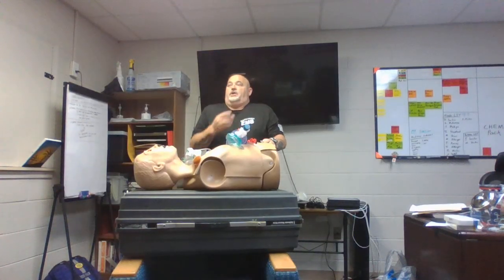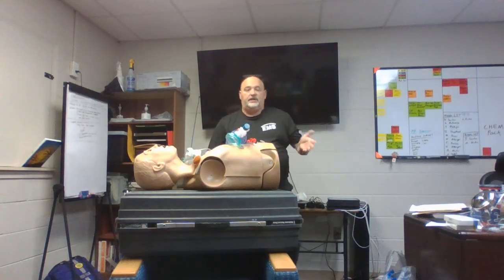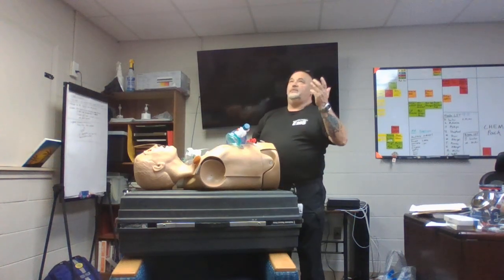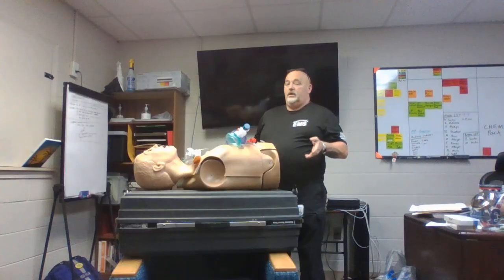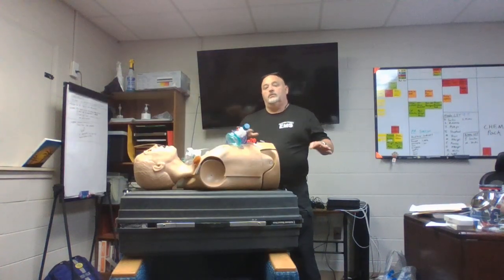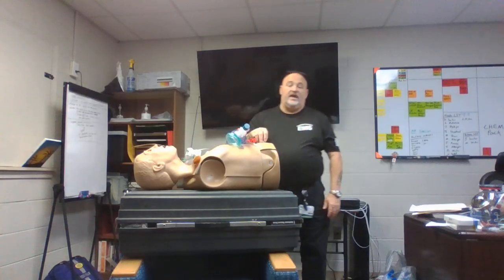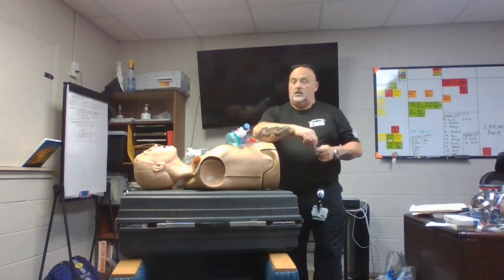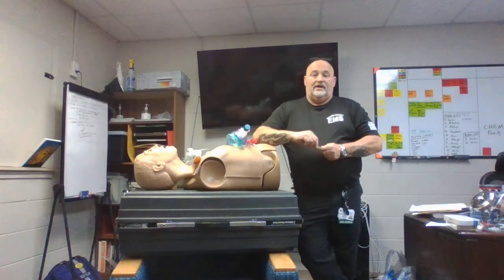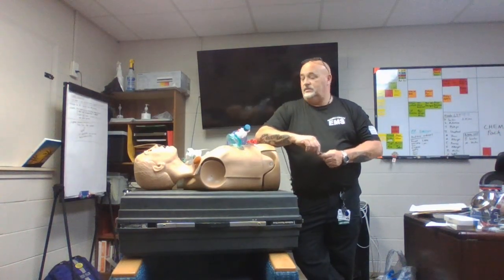You want to listen to those lung sounds, right? You want to know what's going on. Let's look at the O2 side. Has it improved? Has it gone down? Are we oxygenating as well as ventilating? What are we doing, right? So again, I hope all your objectives were met as far as the who, the why, the how, and the importance behind basic airway management.